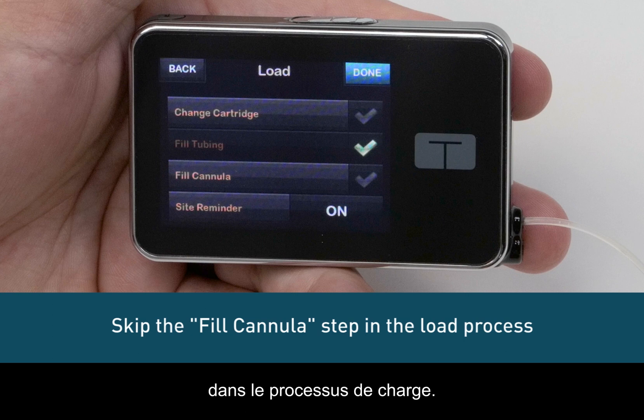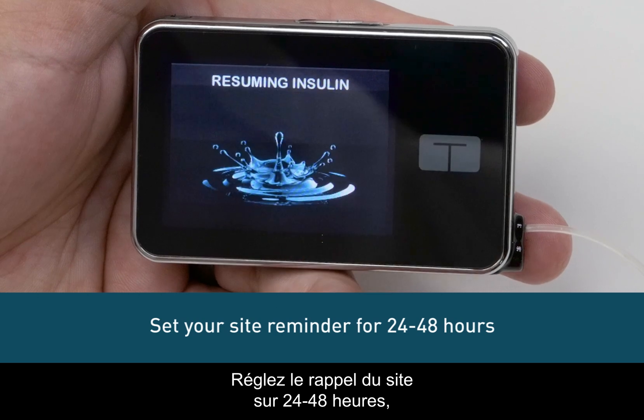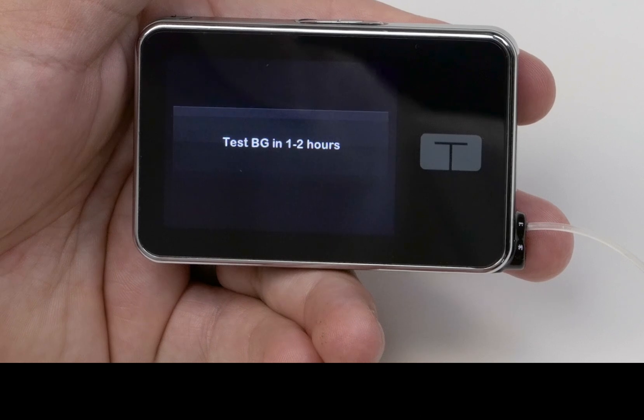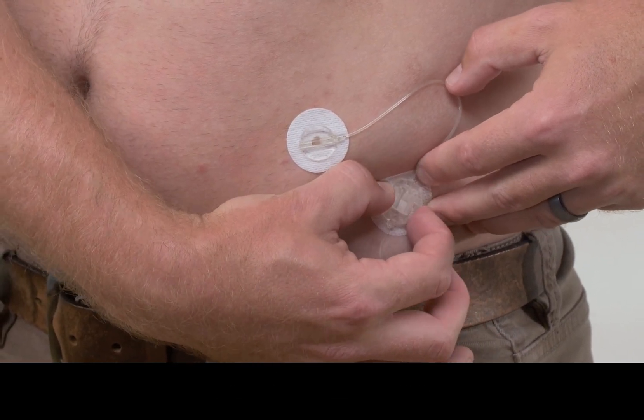Once the set is inserted, you should skip the fill cannula step in the load process. Set your site reminder for 24 to 48 hours, then resume insulin. Always check your blood sugar two hours after inserting to make sure it's working properly.